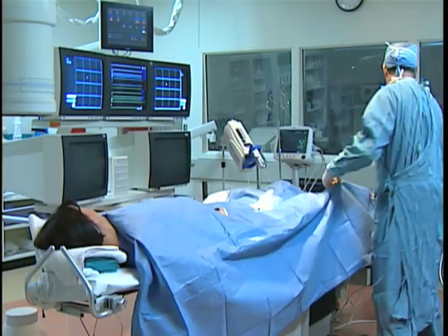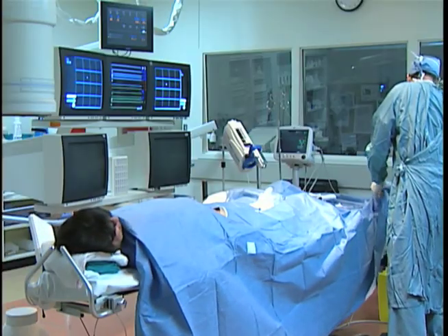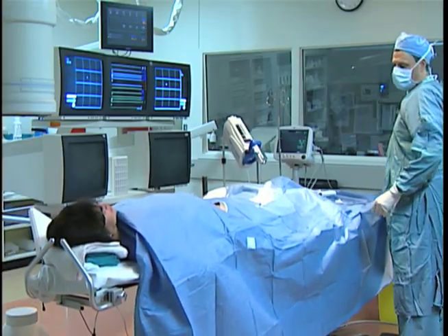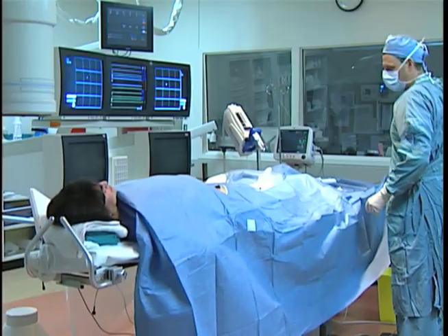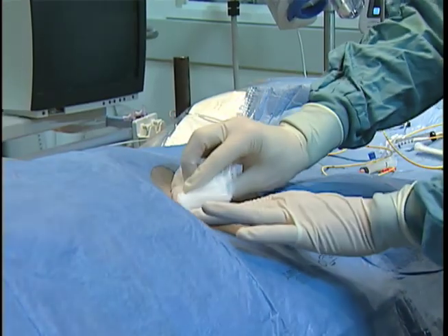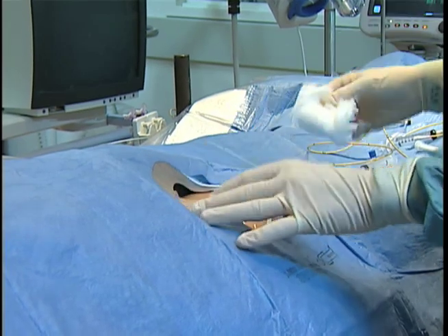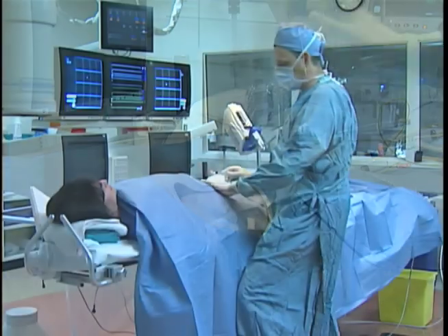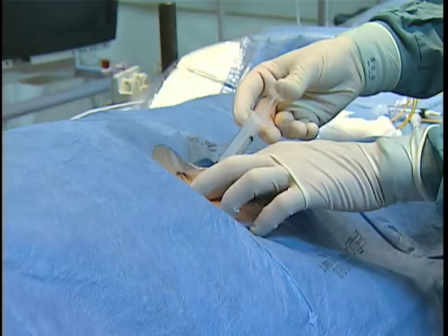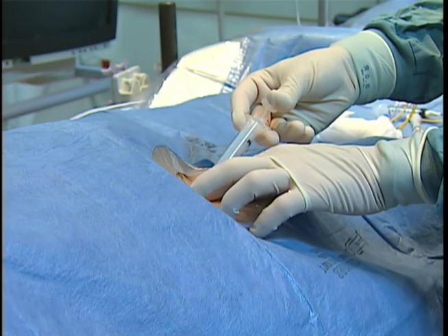You will be asked to lie on an x-ray table. Your blood pressure, heart, and oxygen will be monitored during the test. A small area of the groin or neck will be disinfected where the catheter will be inserted. An anesthetic or freezing medication will be injected to numb or freeze this area.